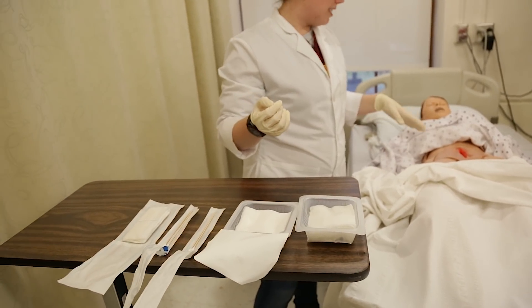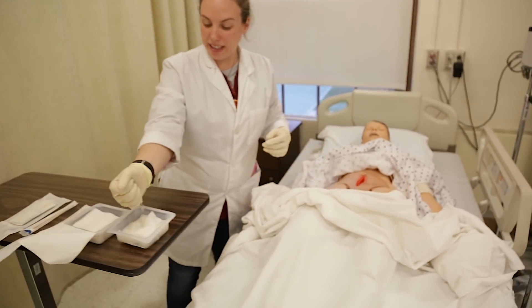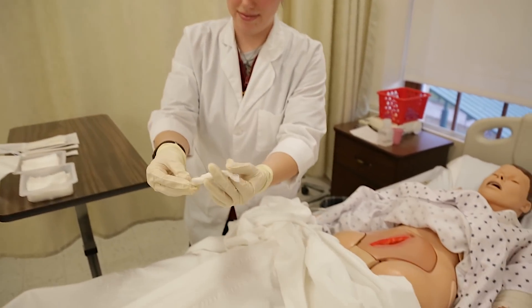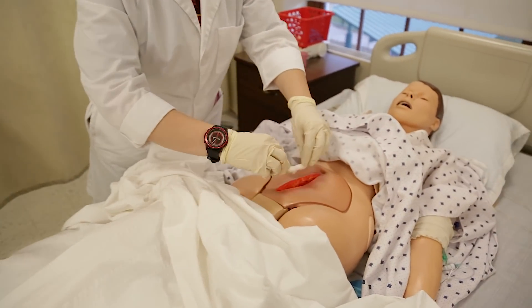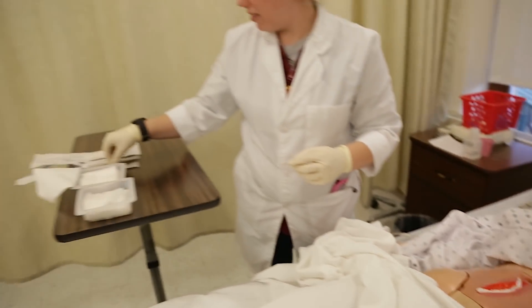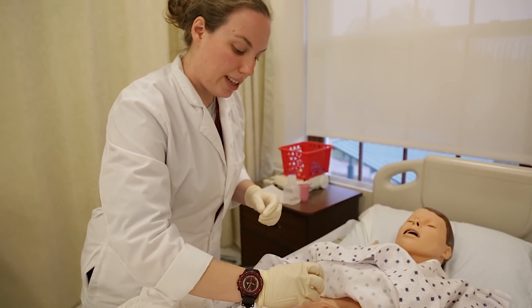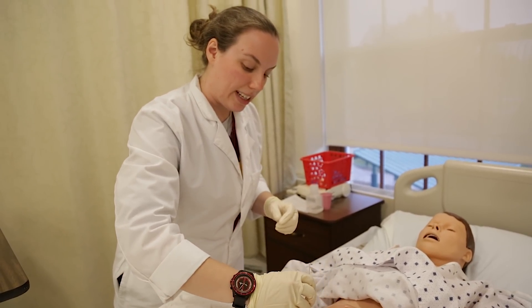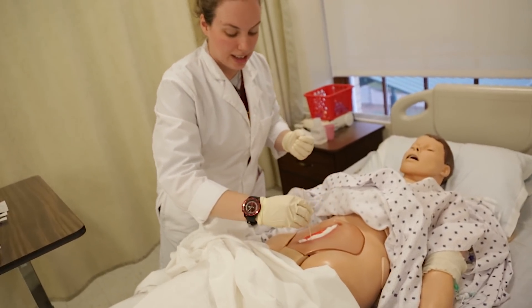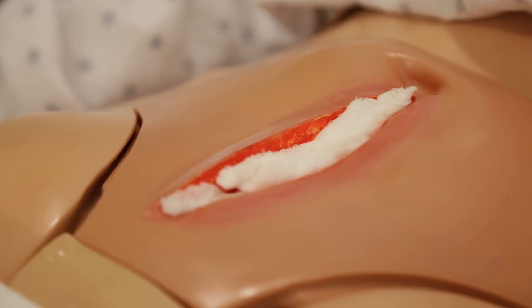We let the patient know we are going to pack the wound. We use the moist gauze — take it and squeeze it so we don't have too much moisture, because too much creates bacteria. We twirl it and then pack the wound. We can't touch the skin because then it creates an unsterile field. It is easier to use the cotton swabs to push it down, but same rule — we can't touch the skin when packing. We do another one, pack it, and make sure it is within the wound and not too much above the skin.